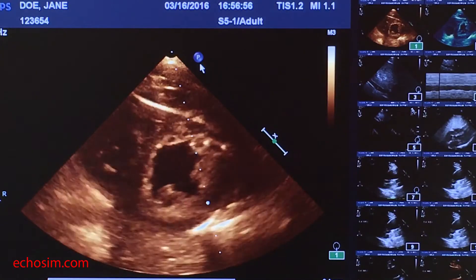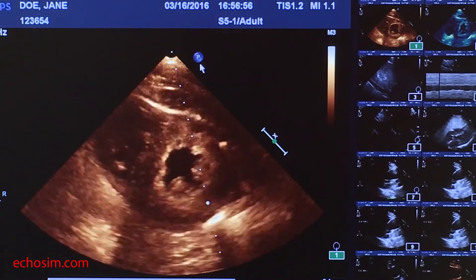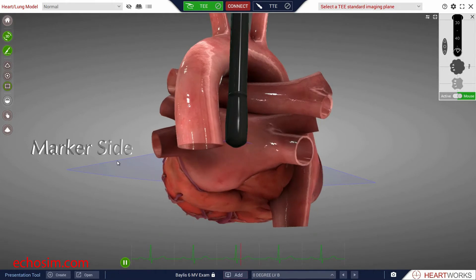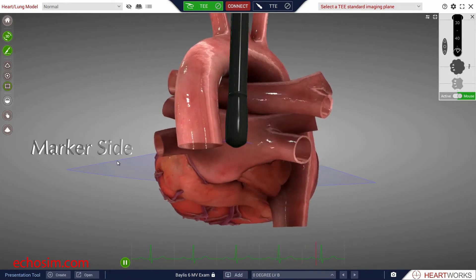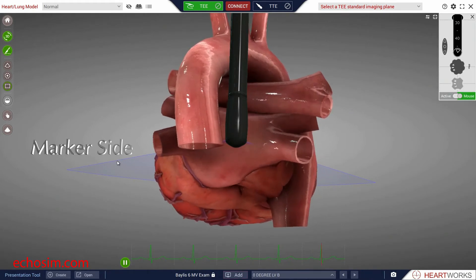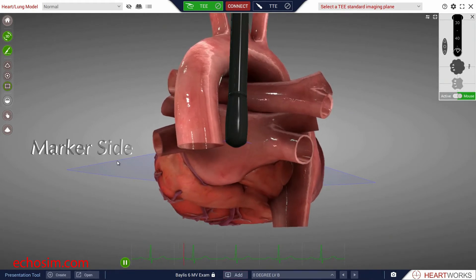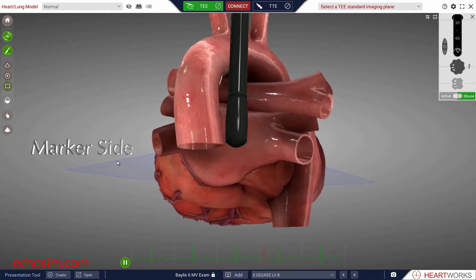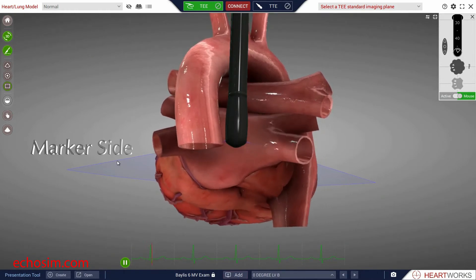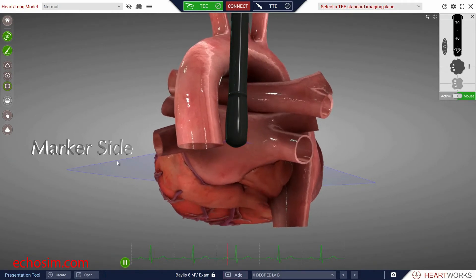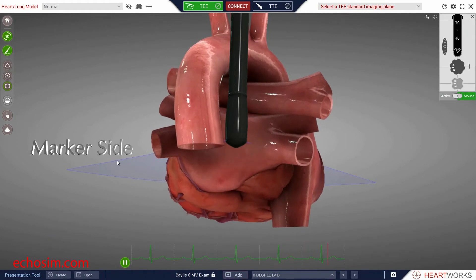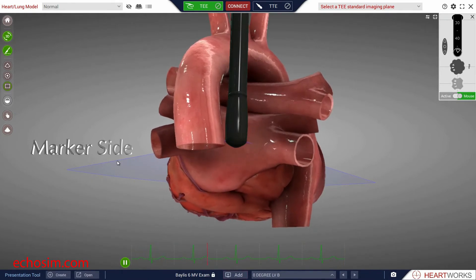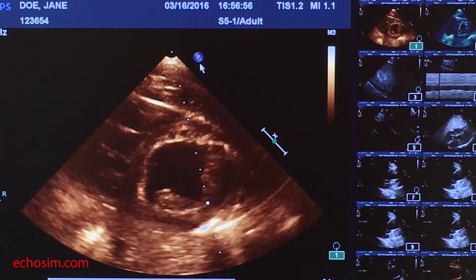However, the same marker is used in certain modes of TEE acquisition to distinguish one side of the omniplane from the other. In TEE acquisition, the displayed plane will also have a marker, which is equivalent to an imaginary marker on the TEE omniplane. Although the TEE probe has no probe marker, the TEE plane can be thought of as having a virtual marker, which corresponds to the left side of the omniplane at 0 degrees when viewed from the perspective of the esophagus. This is demonstrated here on the simulator. The mouse pointer is the virtual location of the imaginary marker.